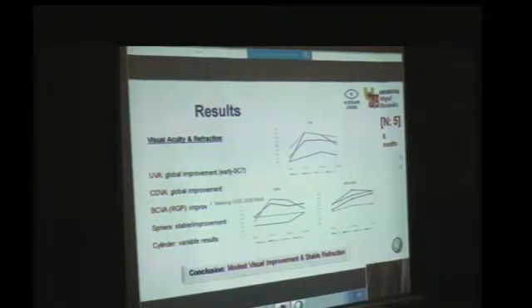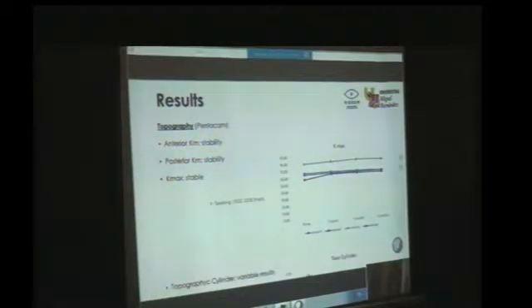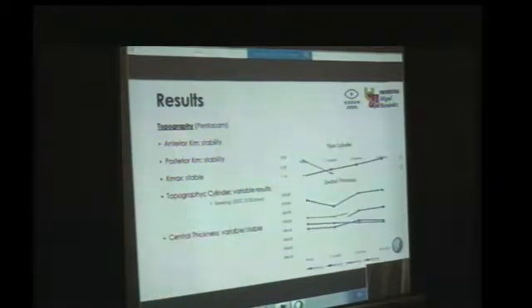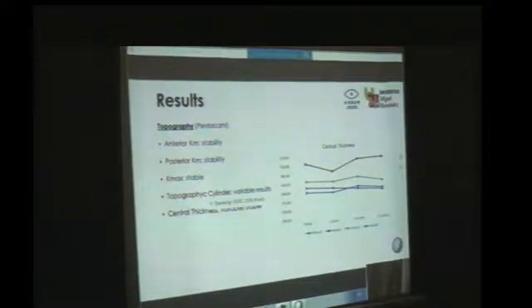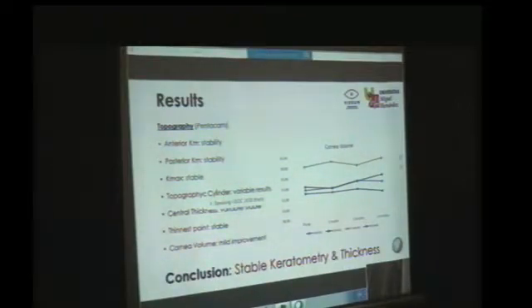And followed by this, we created that plateau. But look here, in the best corrected visual acuity with rigid contact lens, that there was a constant trend towards improvement. So there is an early improvement followed by a late improvement, which indeed this late improvement needs to be caused obviously by the cells. The topography was stable. As you see, according to these graphics, we did not have significant changes in terms of the keratometry. There was a corneal thickness that was stable and increasing with time, and the thinnest point was stable, and the corneal volume was increasing. So we had, as a consequence, at 1 year and 6 months data, an increase in the volume with no changes in the corneal topography in terms of keratometry.